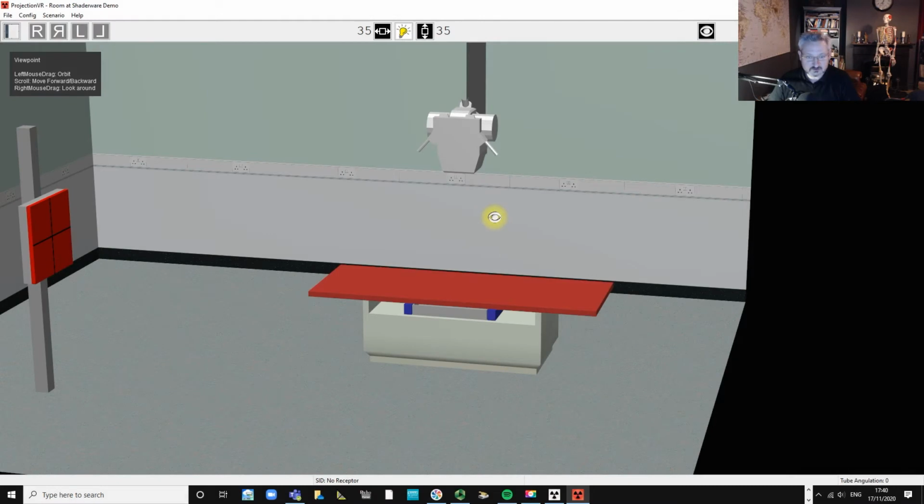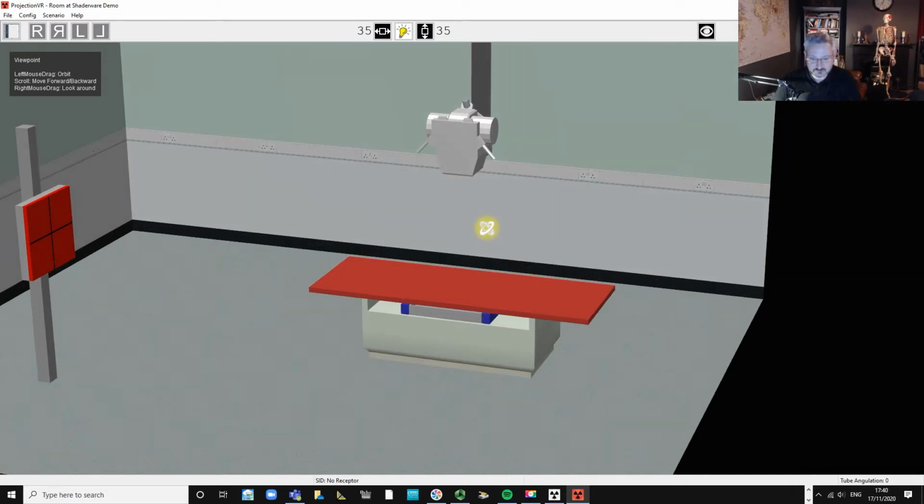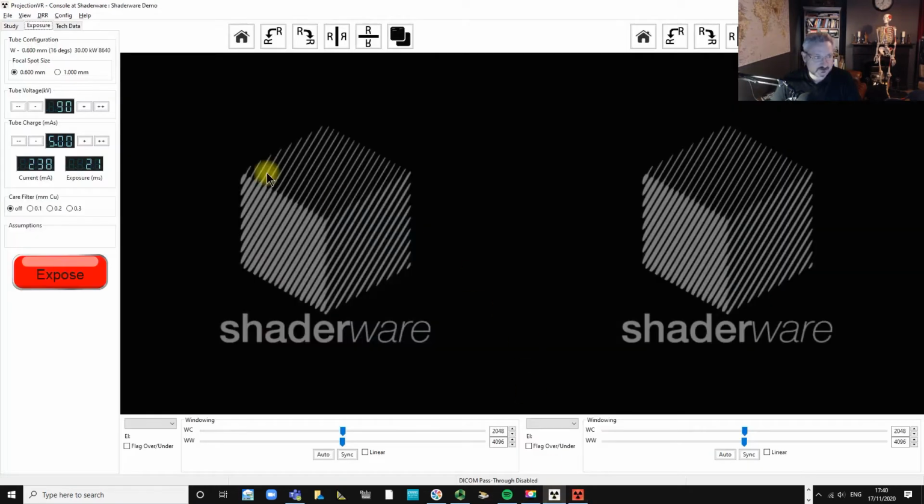In this video we're going to look at x-raying the clavicle in several different ways. So let's pick our patient to start with.